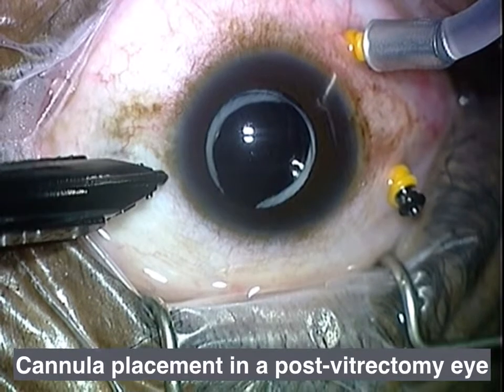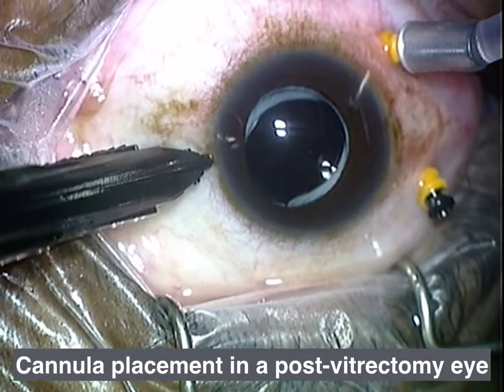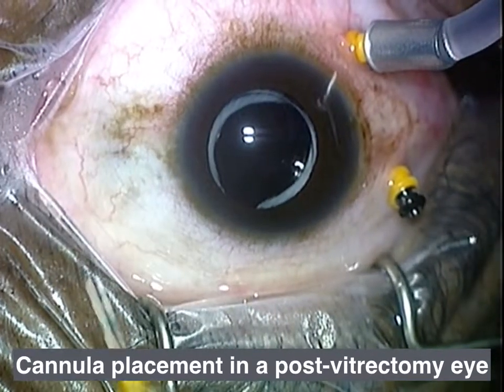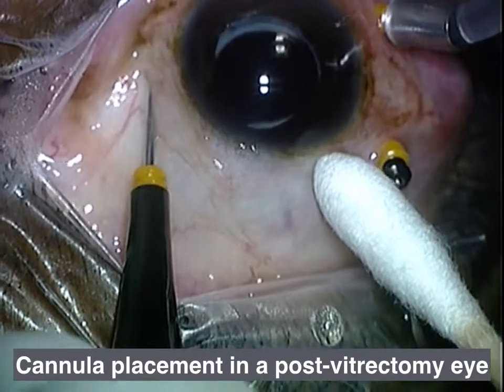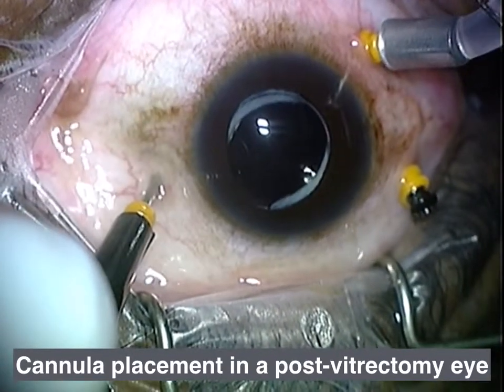I noticed this one time when the eye was full of vitreous hemorrhage — a post-vitrectomy vitreous hemorrhage — and all the blood went up into the infusion line, even though I had the infusion pressure up to 60. So I know that the pressure we exert by placing these sclerotomies exceeds 60 mmHg, and that means just putting your pressure up to 60 does not preclude this from happening.